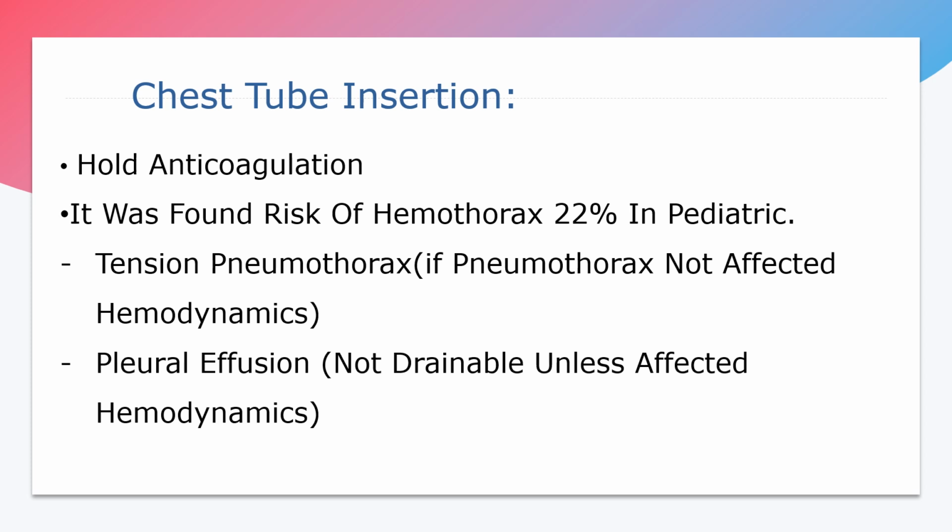If the pleural effusion doesn't affect the hemodynamics, we should delay draining it.